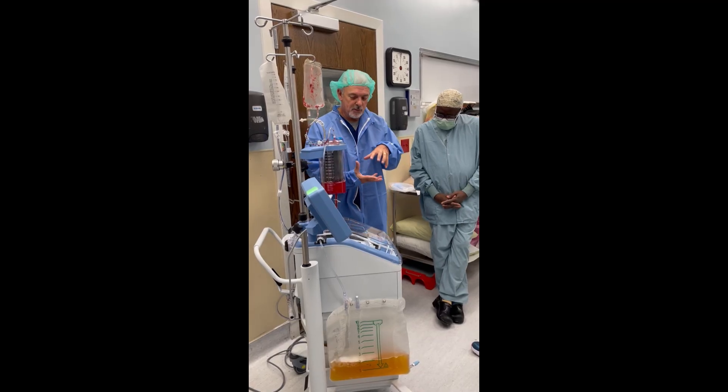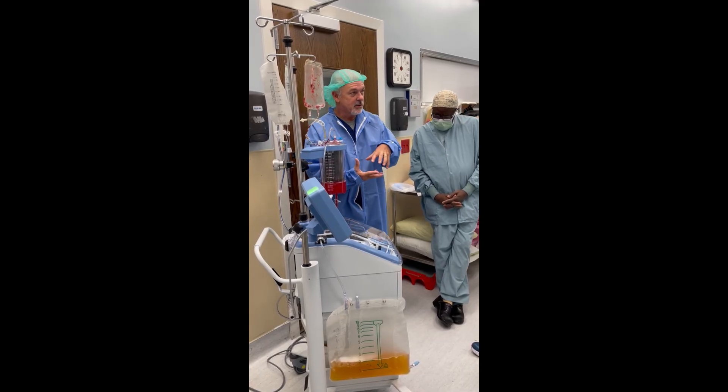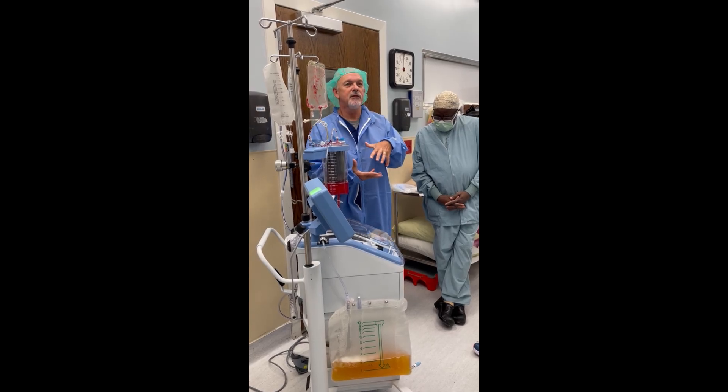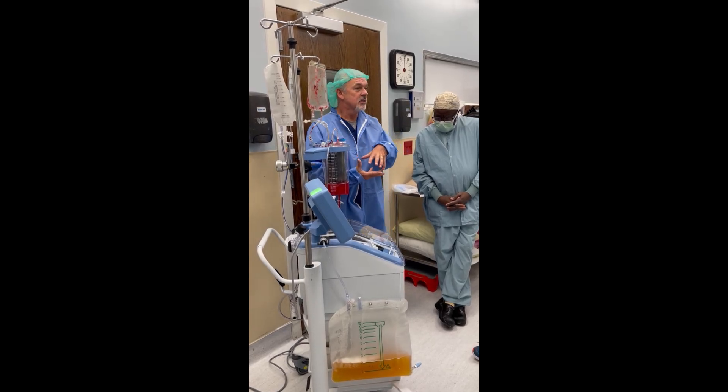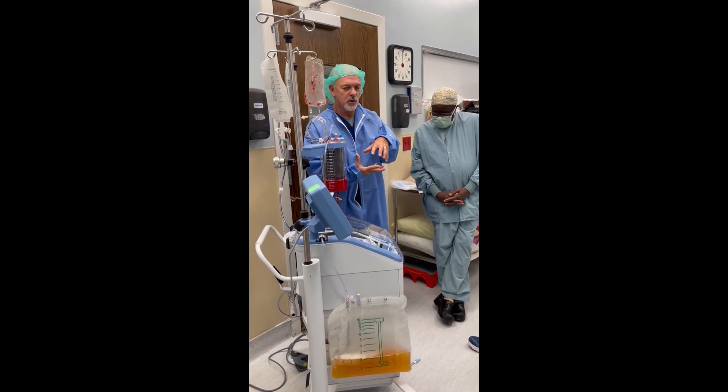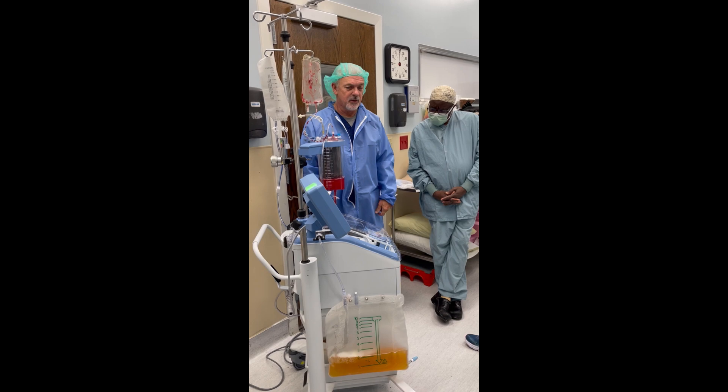So all you're giving back to the patient are red cells suspended in your wash solution. That's going to be at a crit between 55 and 65 on average. It kind of depends on what comes in, but that's where we'll concentrate it — about 55 to 65 — which is really nice.